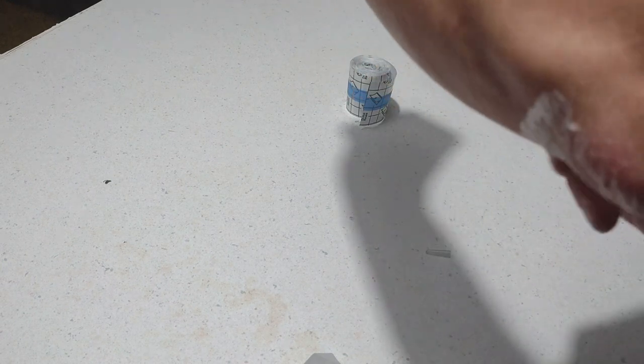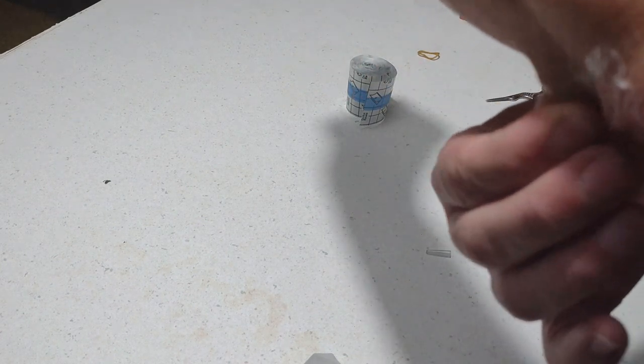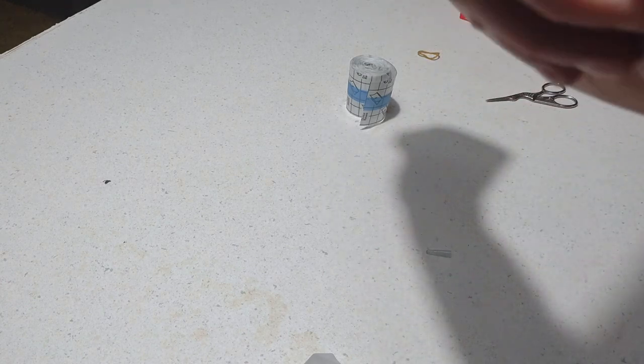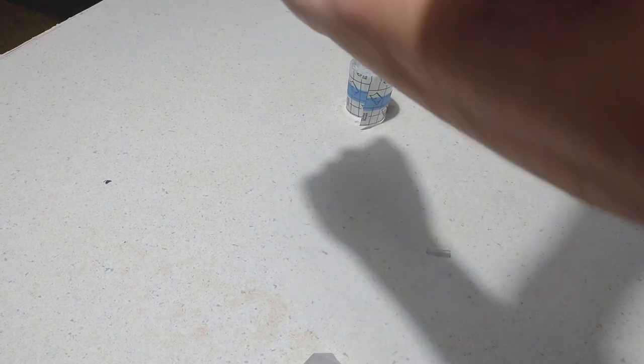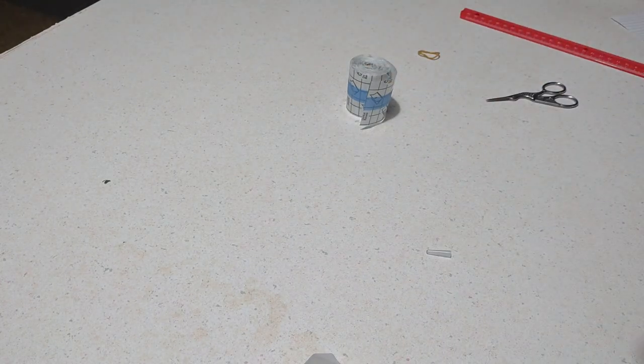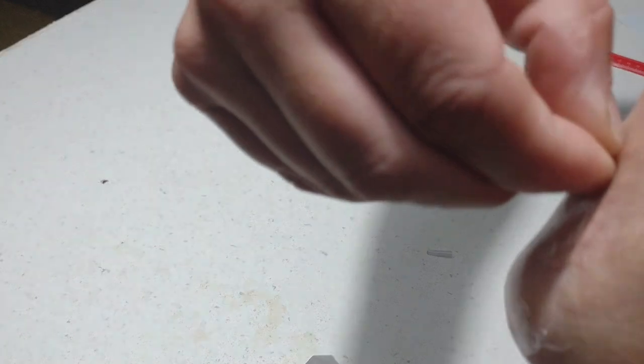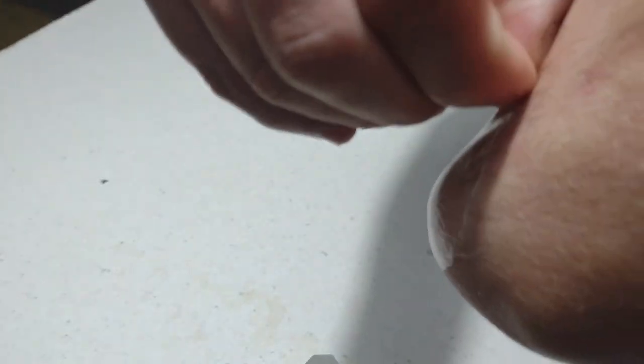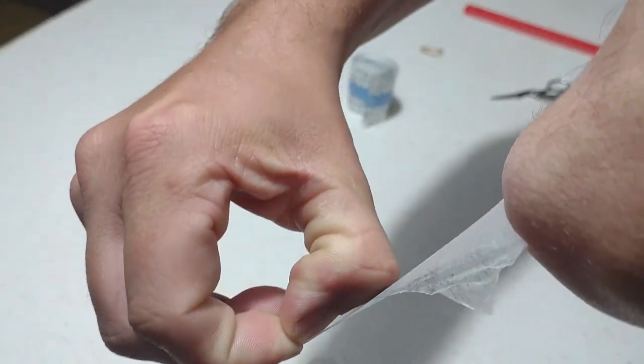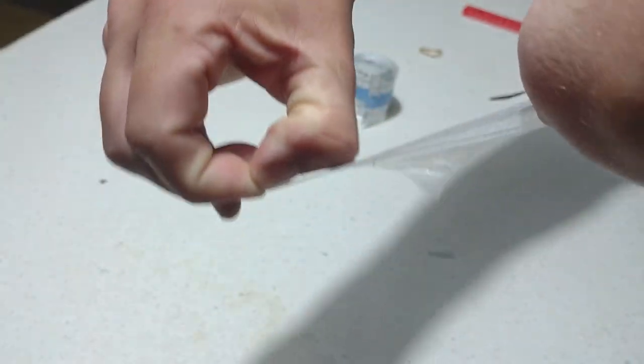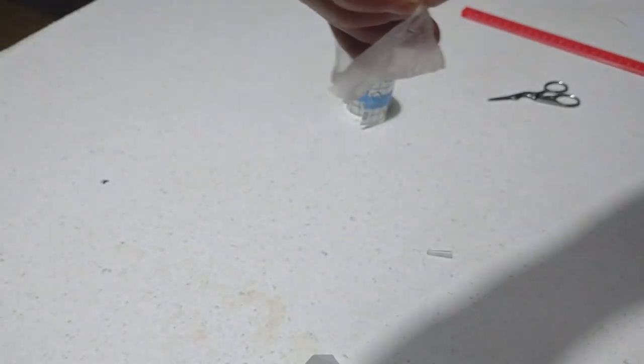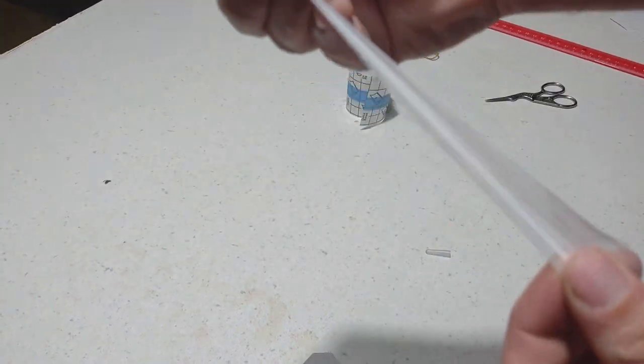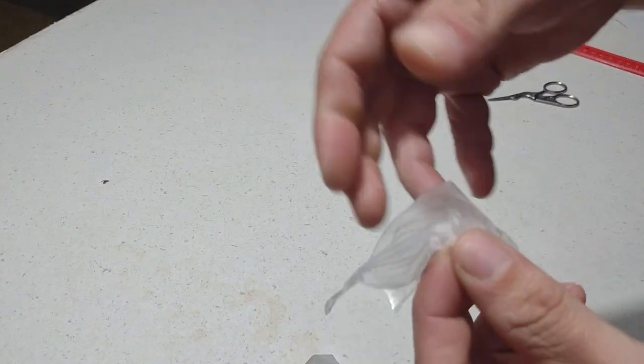And then when you're done you can just peel it off. Very stretchy.